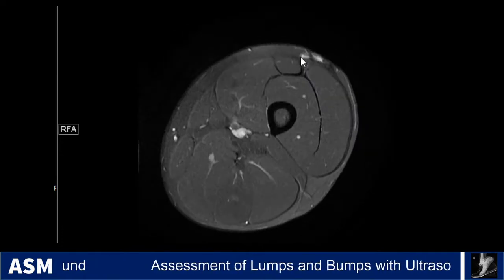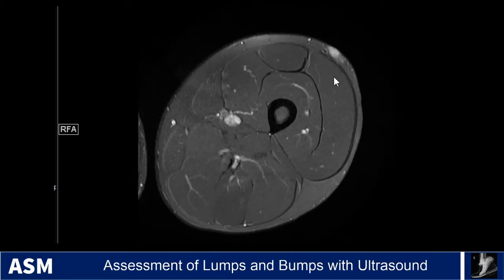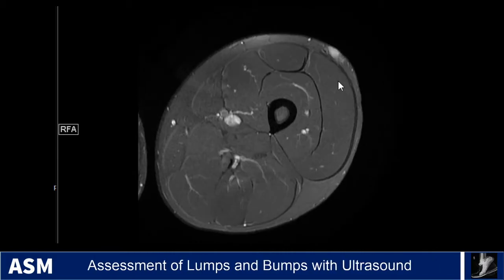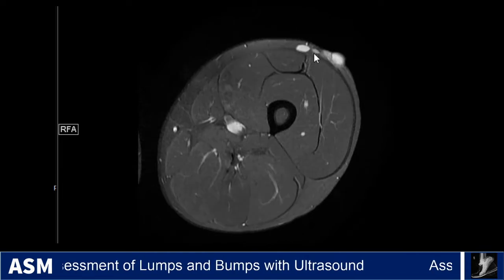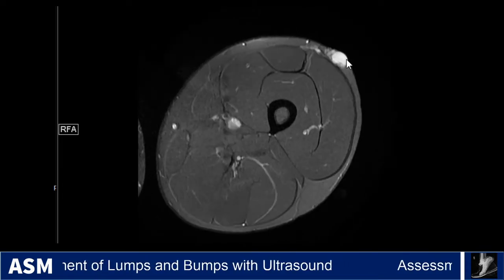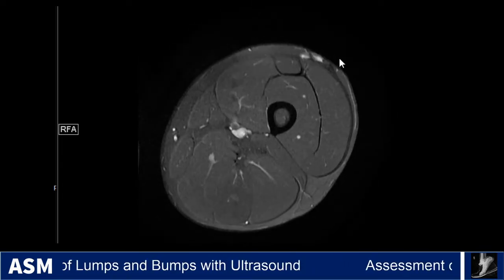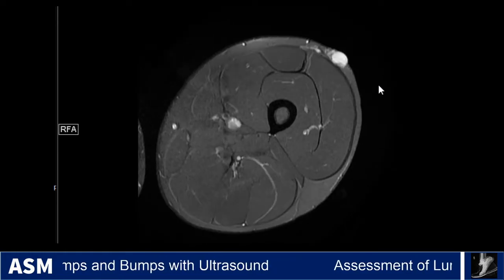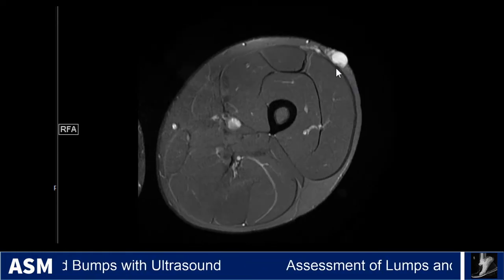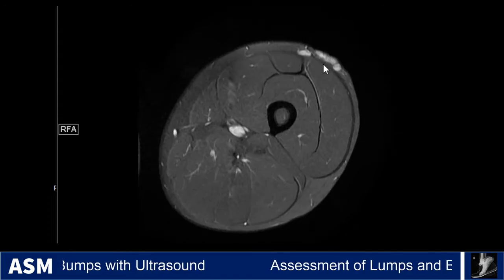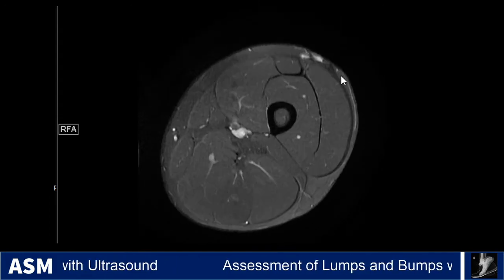This is not consistent with a lipoma by ultrasound or by MRI. It has this nodular protuberant appearance in this superficial soft tissue mass. This is a case of dermatofibrosarcoma protuberans — and this is actually a recurrence. You can see the scar where they previously excised the mass, and it has grown back.